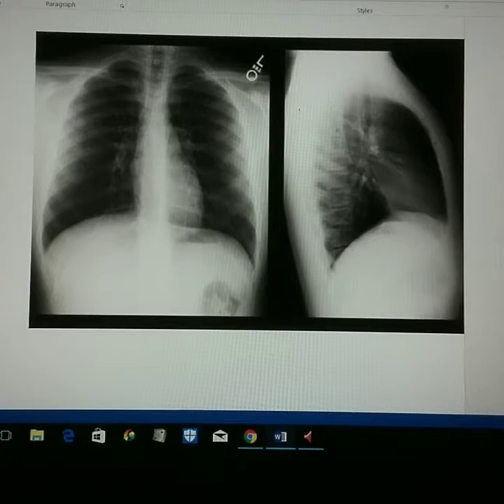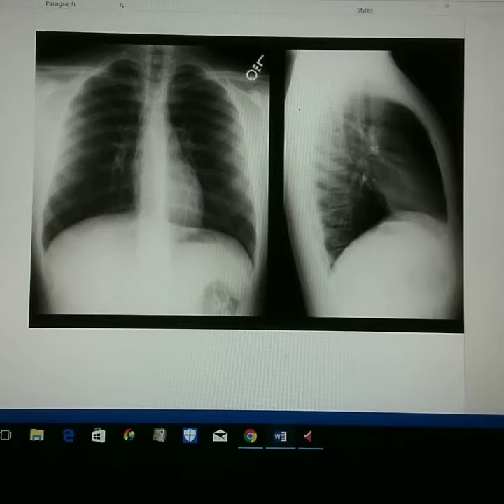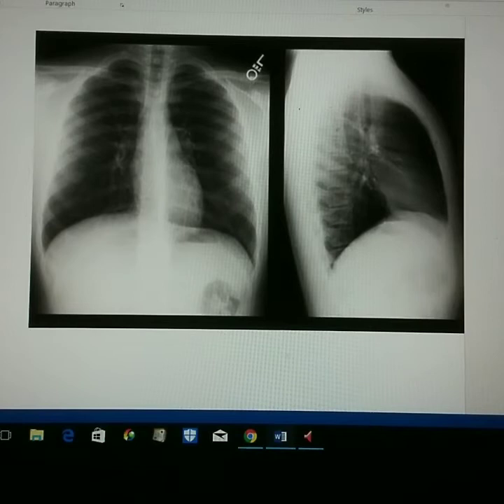The hilum would be in the center, as evidenced here — the hilum is in the center of the lungs. We also want to make sure we have our posterior ribs superimposed on each other, as well as open thoracic intervertebral spaces, which is evident there.